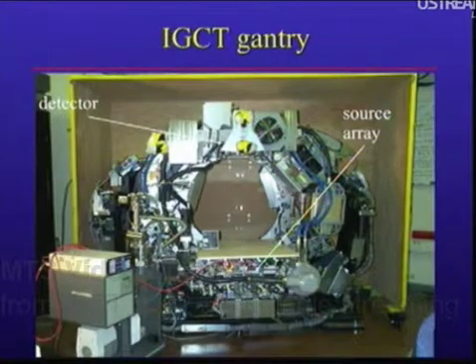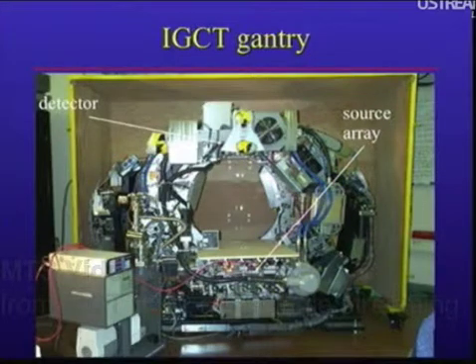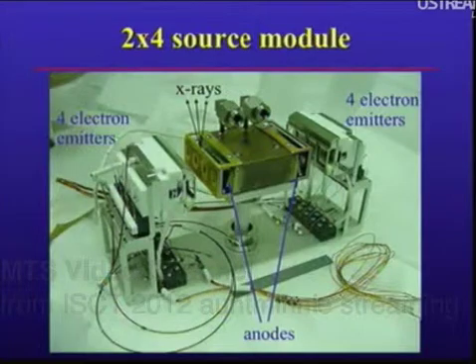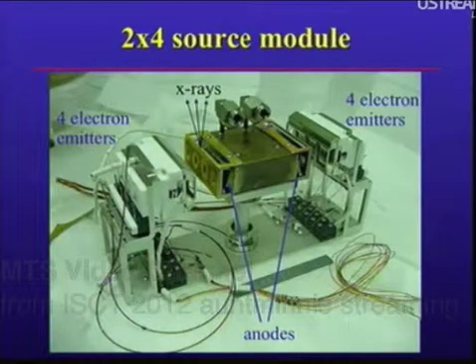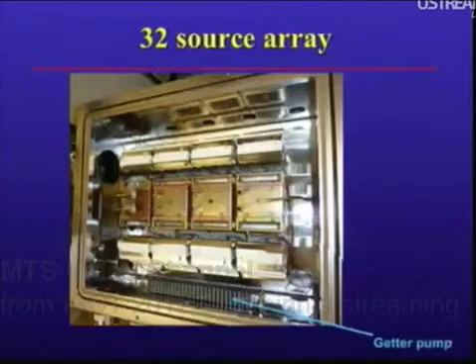This is what the scanner looks like. It has a source array that you see on the bottom, the detector array on top. Looking at the source array, it's built out of source modules. Each module has 8 sources in it. There are 4 electron emitters and then 4 X-ray tube targets in the central part, and the X-rays come out the top, as you see there.